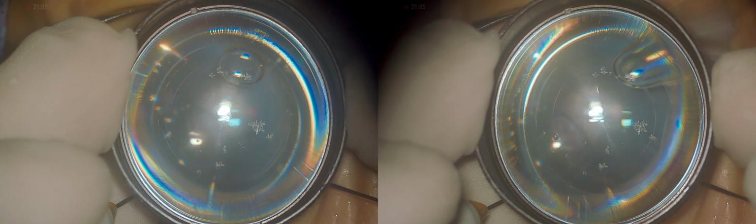Perfluorocarbon liquid was injected on the retina surface. Laser was spotted at retina defects and at the peripheral retinotomy as a barrier around both its anterior and posterior edges. Laser is also made 360 degrees around the retina.